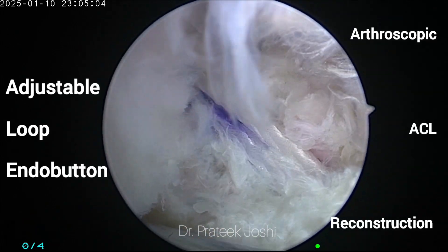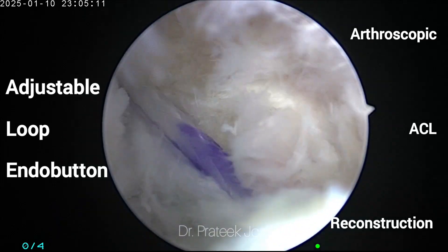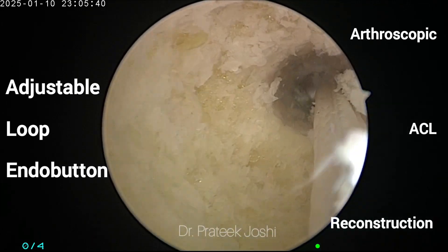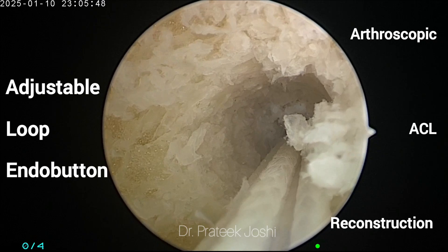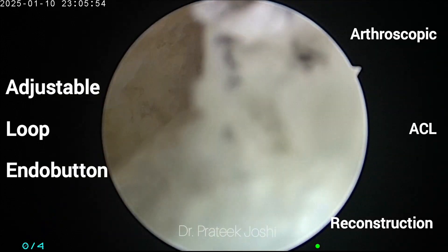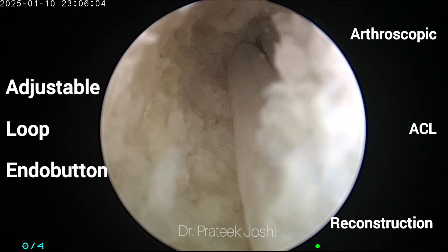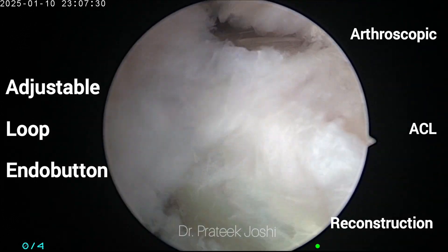At this point we are going to flip our button, and at the same time we are also going to confirm that the button has flipped by seeing it visually through the anteromedial portal. You are clearly seeing that the button is advancing through the lateral border of the lateral femoral cortex, and now it is outside the lateral femoral cortex — at this point we are going to flip the button. Both tactile confirmation and visual confirmation are present that the button has flipped.